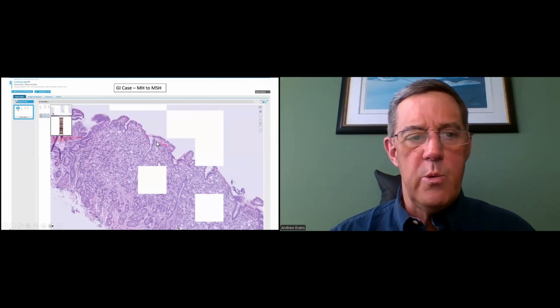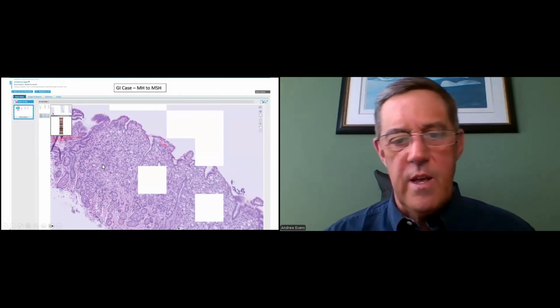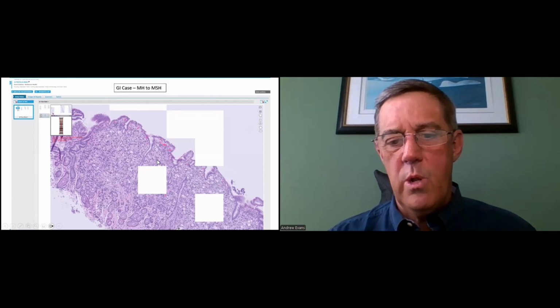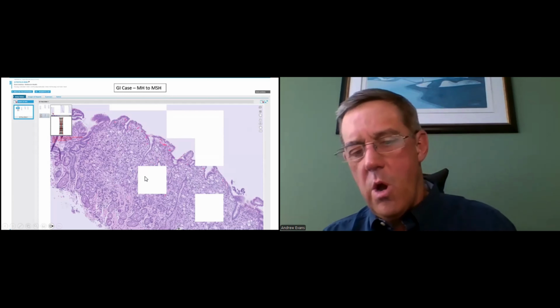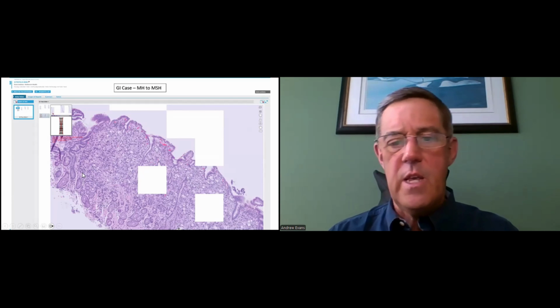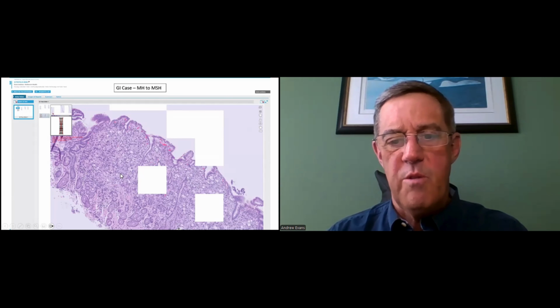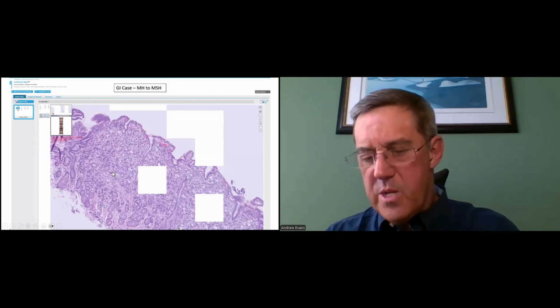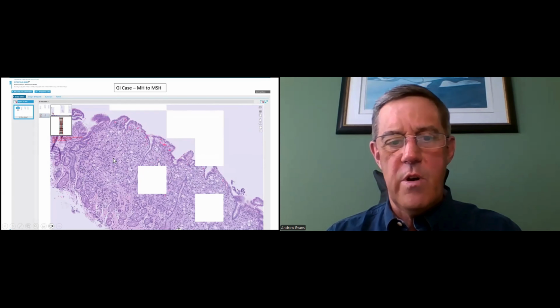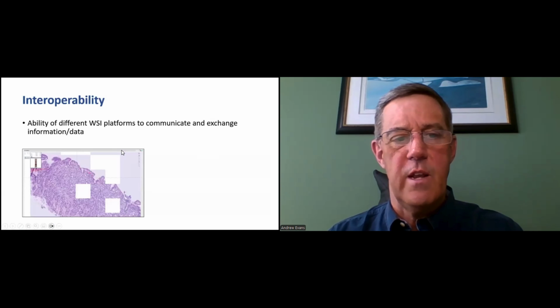When we uploaded to the third-party platform, to share with colleagues at Mount Sinai, we noticed there were these large white patches where whole areas of pixels just didn't cross an interface. And this required a major software rewrite on the part of the third-party solution provider. So again, this really speaks to the need for interoperability and checking these things very carefully as you go and looking for these problems, which really can sideline an entire project or delay it significantly.